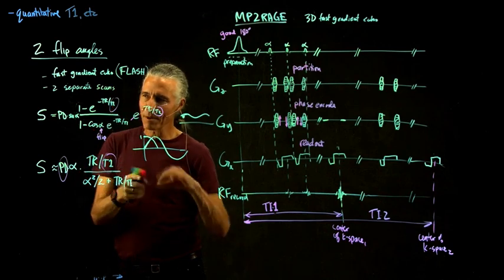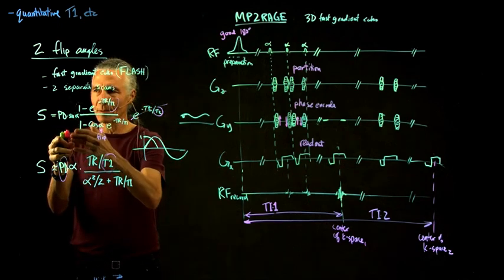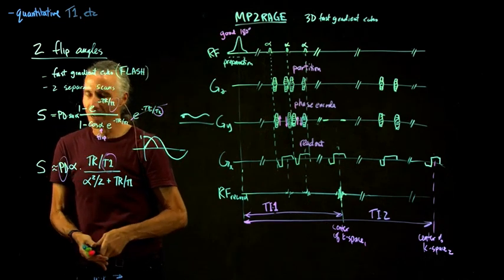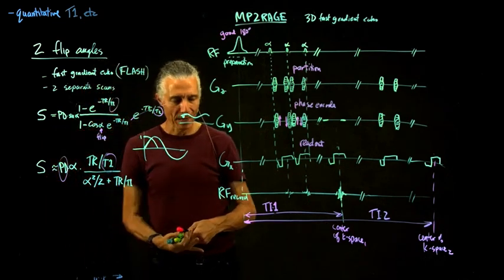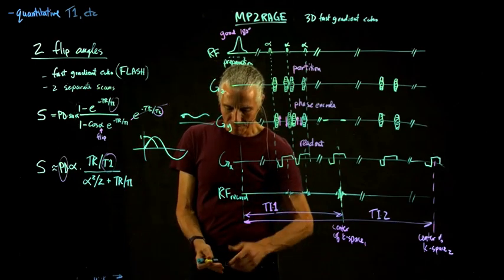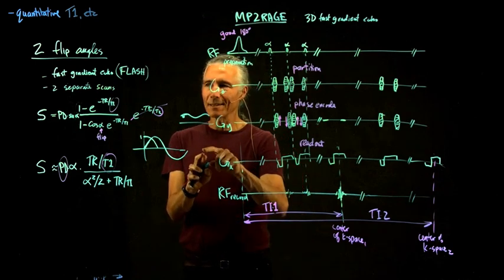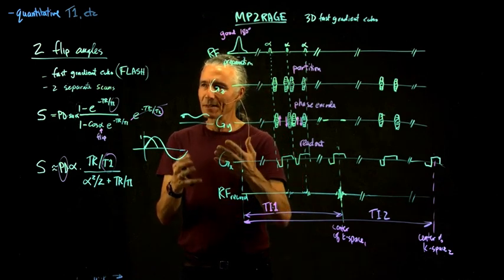You still have the problem of all the speckling in the air, but again, you could just go back to the individual images and try to figure out where the air actually is. And the speckling comes from the fact that you're taking two very noisy signals and interacting them with each other, and then you get noise out of that.